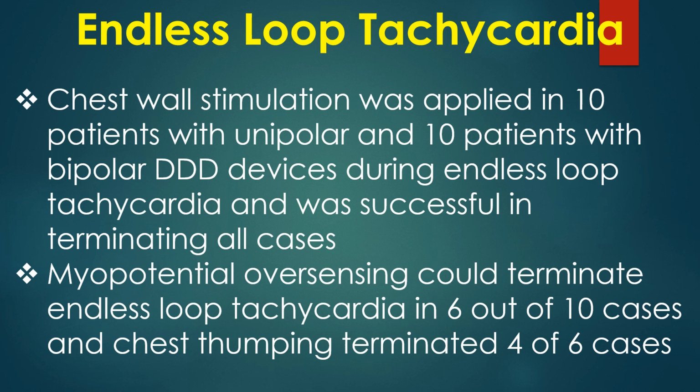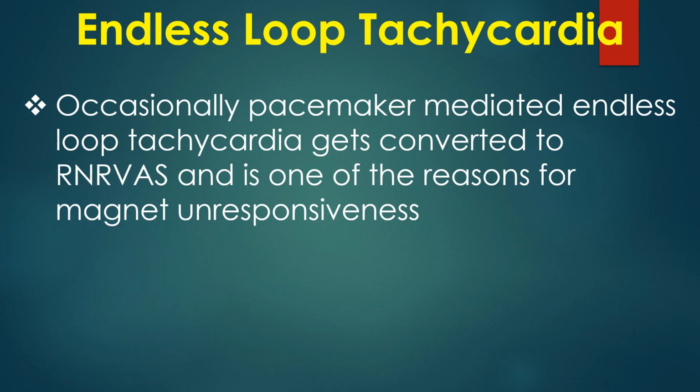Myopotential oversensing could terminate endless loop tachycardia in 6 out of 10 cases and chest thumping terminated 4 of 6 cases. Occasionally, pacemaker mediated endless loop tachycardia gets converted to RNRVAS and is one of the reasons for magnet unresponsiveness.